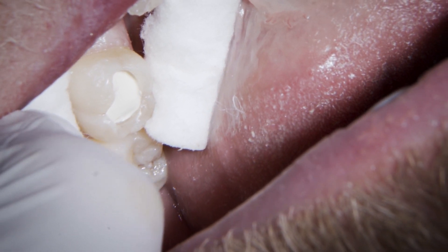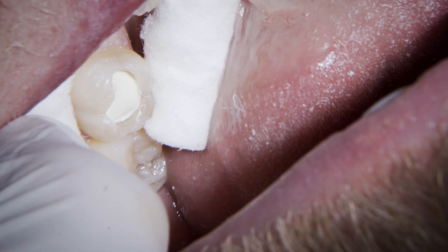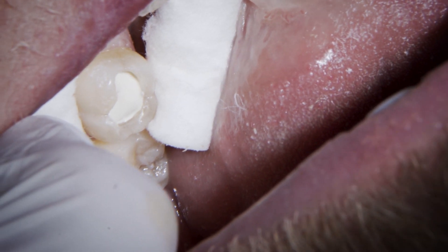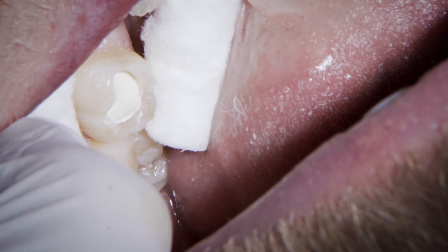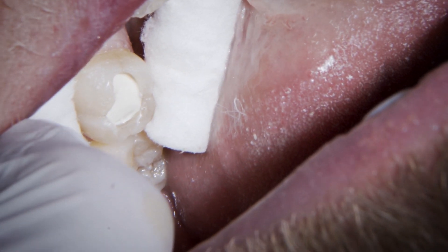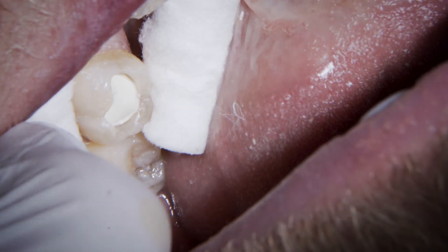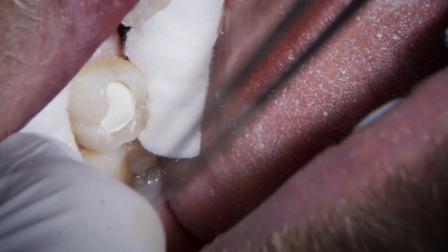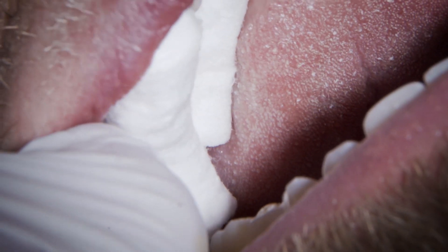We'd set the timer now — it's been running since the biodentine was mixed for 15 minutes. Under ordinary circumstances we'd plan to do other jobs in the mouth, looking at the treatment plan and incorporating that timing so it's not dead time at all. If there's nothing else, I'll use it to write notes. We'll let the patient relax — once I've got that initial setting and it starts to retain its shape, I'll roll that surface over and then let the patient have a little rest.